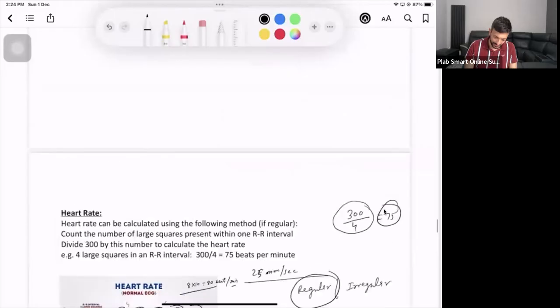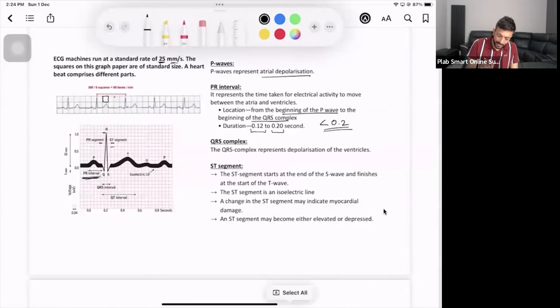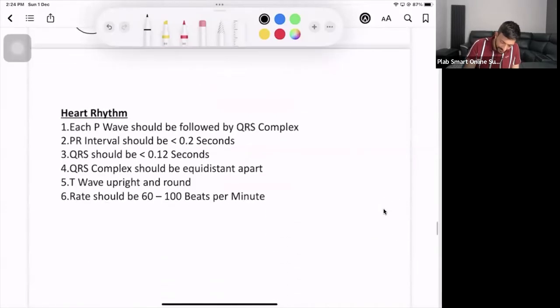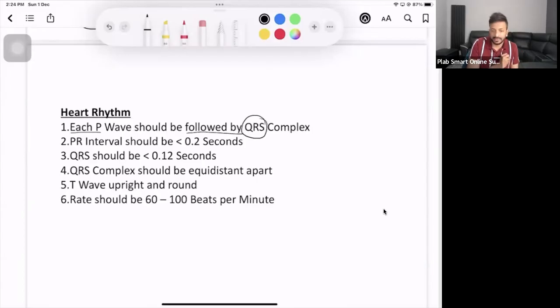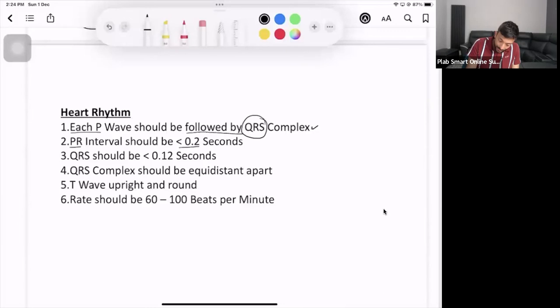To summarize what's been covered: P wave is for atrial contraction, QRS complex is for ventricular contraction, T wave is for ventricular relaxation, and you've explained how to check heart rate for regular and irregular rhythms. Now make sure to cover these six key assessment points. First: each P wave should be followed by a QRS complex.